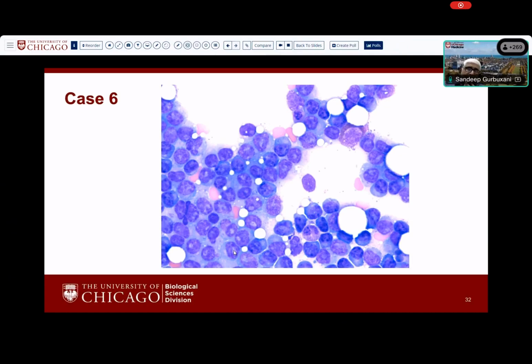And in this particular case, we have the immunophenotype confirmation of that. These are CD38 and CD138 positive cells that don't express CD19. They have a variant expression of CD56, and they were kappa light chain restricted. So you can sort of see the most mature plasma cell here, and you can track the similarities to that cell and the other cells present in the field.